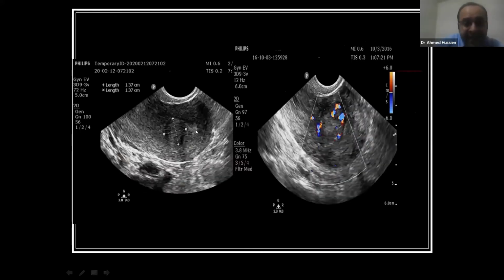And if you add 3D ultrasound, it gives information. The second is the myometrium, myoma in the cavity. It is the same echogenicity of the myometrium. If you add Doppler, it is a circle around it.